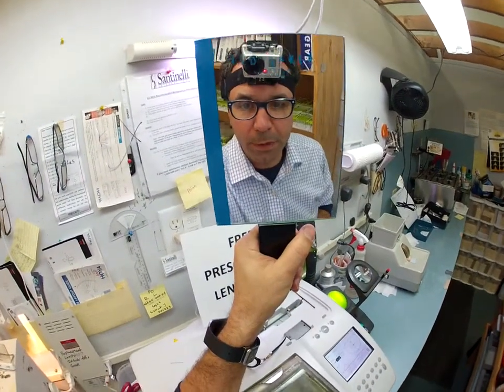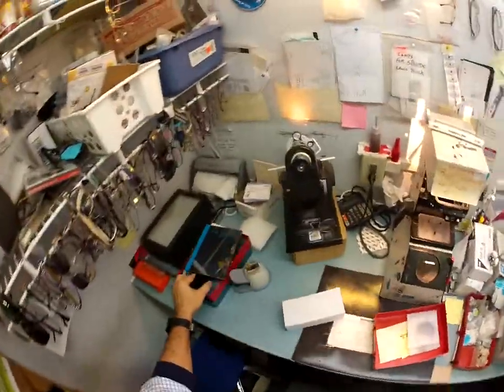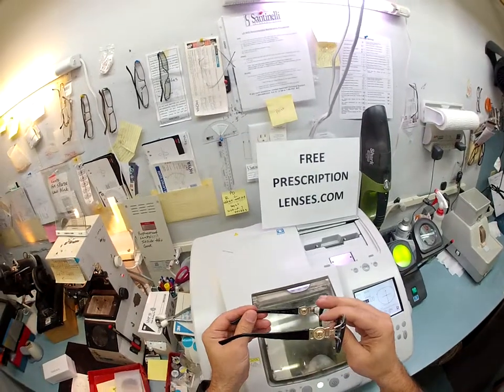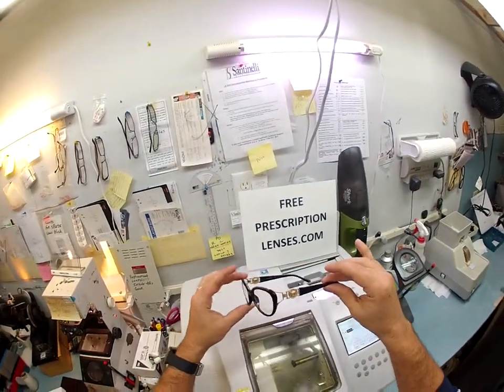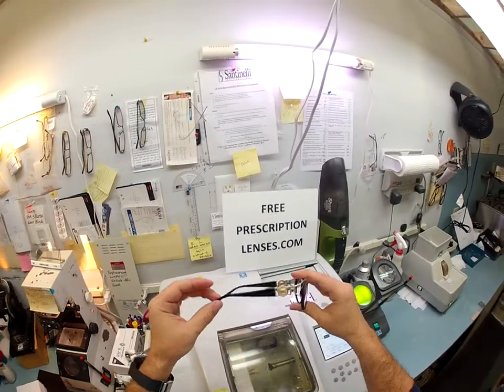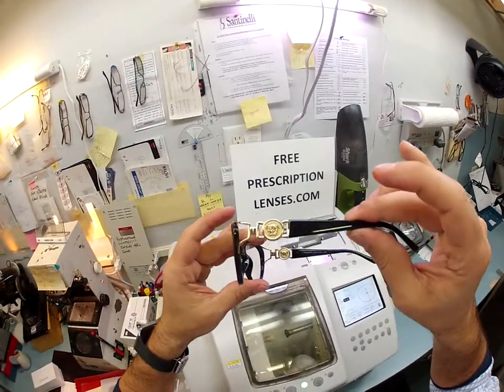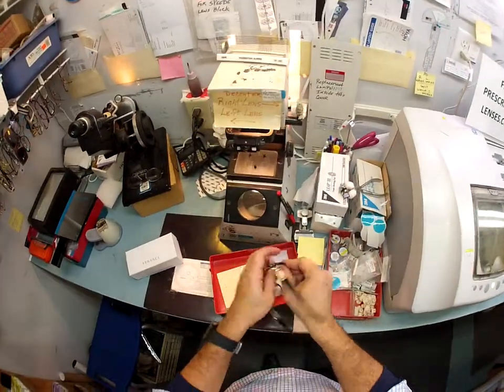Matthew here with freeprescriptionlenses.com. With the help of my GoPro camera I'm going to show you how I cut bifocal lenses for your Versace — model number 3167, size 53, color GB1. This is the classic black and gold Versace with the lion print on it. First things first, I'm going to pop out the original demo lenses.